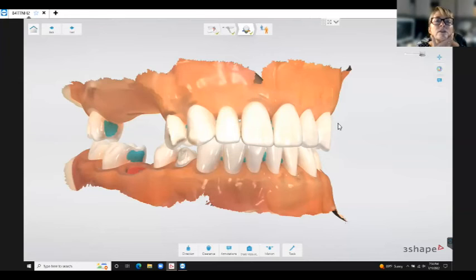So we do have a couple questions up here from Robert for the remake in the first denture case. One doesn't need the scan of the edentulous arch. If I'm reading that and hearing it correctly, you're asking if scanning the intaglio of the denture with the wash impression is adequate and that you don't have to scan intraorally. If that's your question, the answer is yes. And if that's not your question, maybe try to rephrase it.